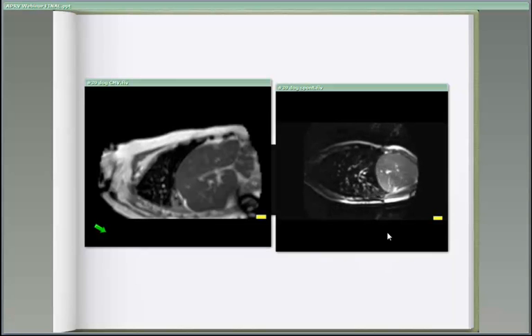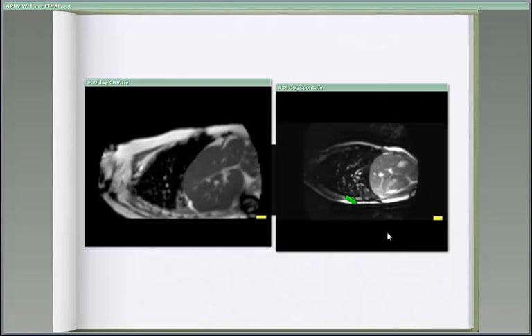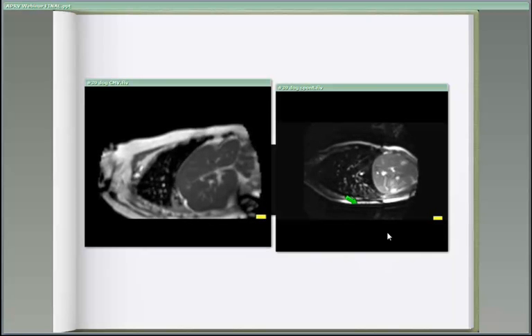And you can see that the chest wall actually moves very little. In fact, the abdomen moves more. And you can see that there's much, much more excursion in the dependent areas of the lung. So we may actually be getting a better distribution of ventilation with spontaneous breathing. And again, the key is that you pull the air into the lung.